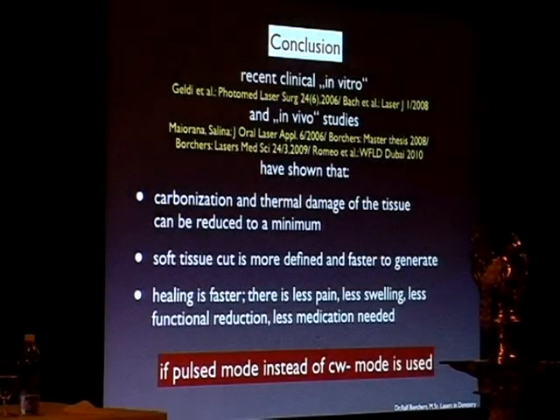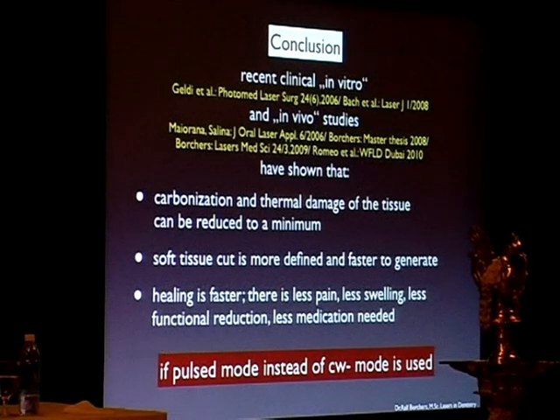So as conclusion, out of a lot of investigations and examinations, if pulse mode is used instead of continuous wave mode, you will get a better result for you and for the patient.